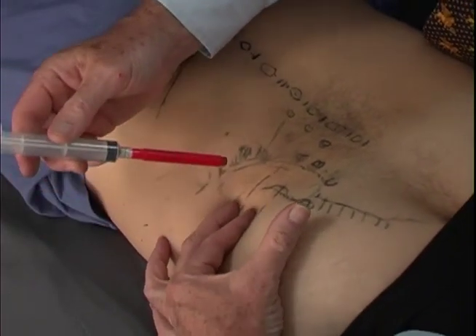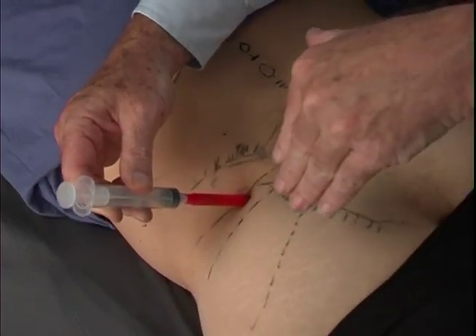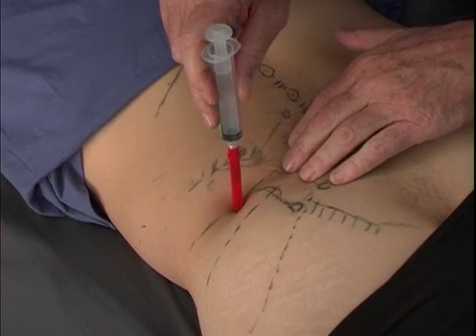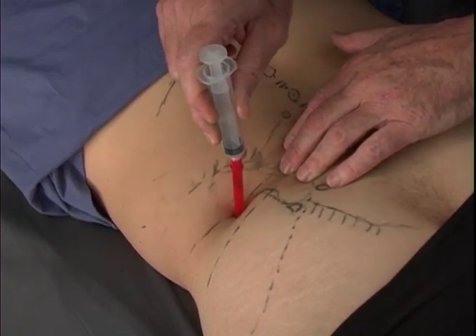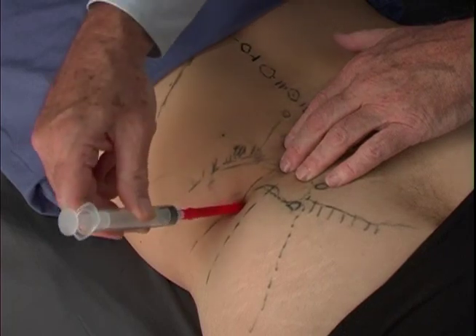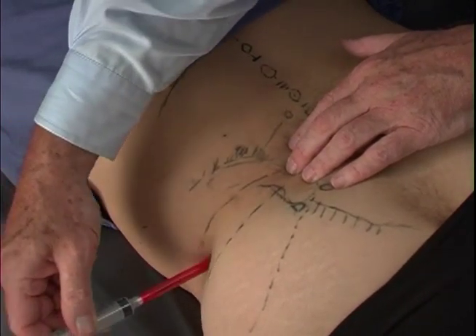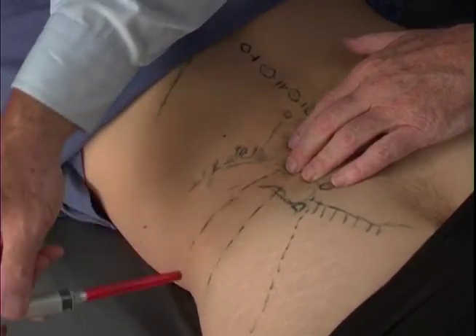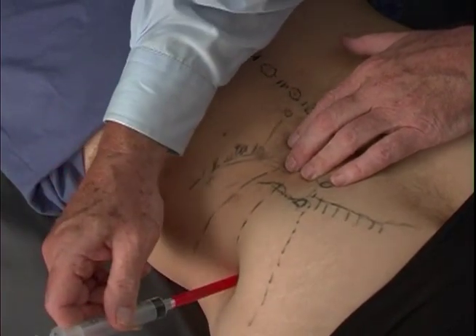And then we begin our injections in the gluteal muscles by coming with a lot of finger pressure down, pressing in on the tissue, and coming in, remembering that the ilium drops off fairly dramatically here, so that if our injections are carried out downward like this, we'll just slide off the side of the ilium. Our needle has to be oriented medially, and the further down we come, the more medial our needle has to become, so we're almost directing our needle straight toward the spine when we get down laterally on the ilium.